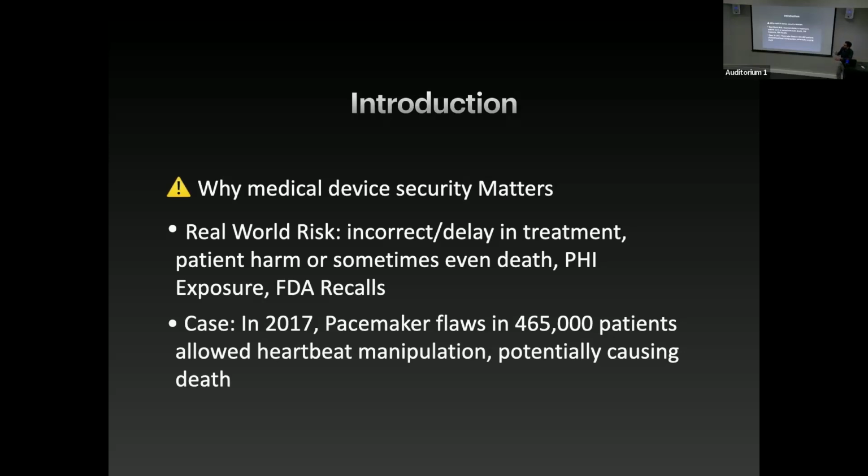If the devices are ready to accept remote firmware, if they have the capability of updating the firmware remotely, what are the pros, what are the cons? Do we have good security controls? These are the questions that we need to ask ourselves before implementing security controls in high-stake technologies like medical devices.